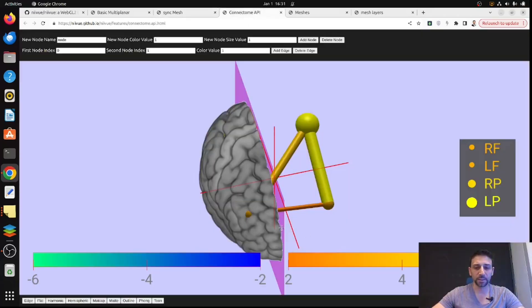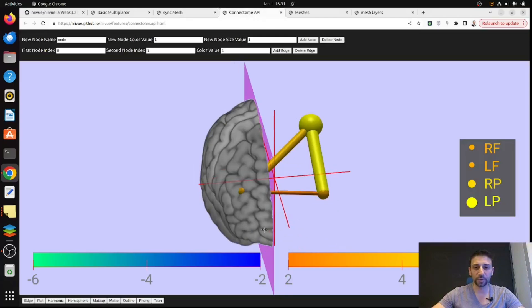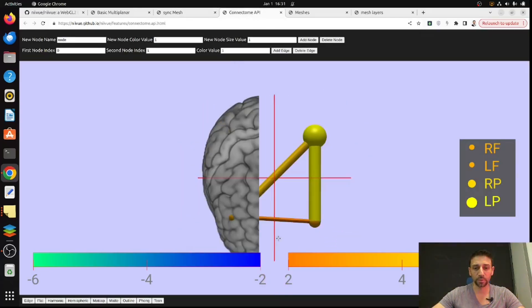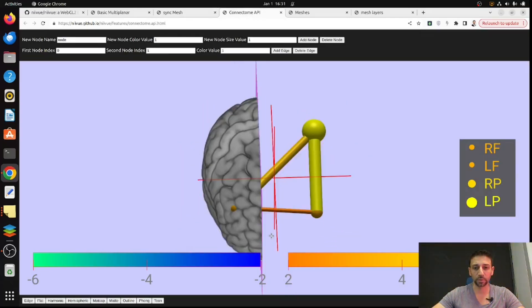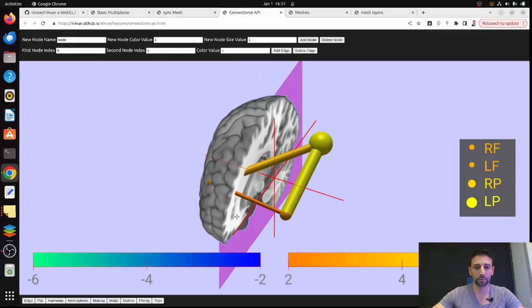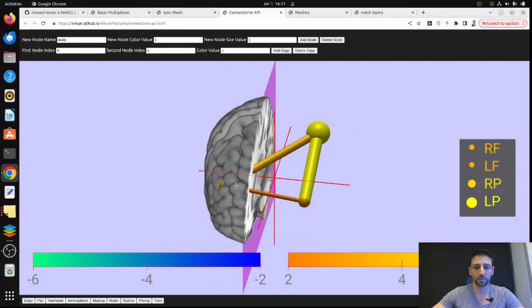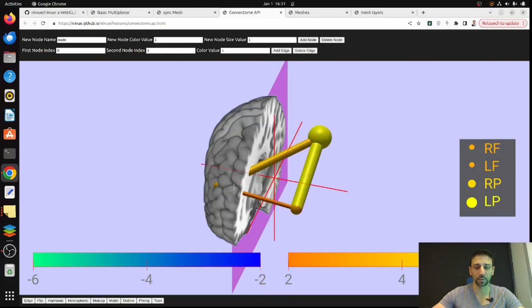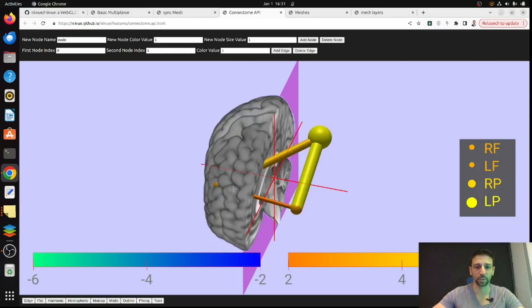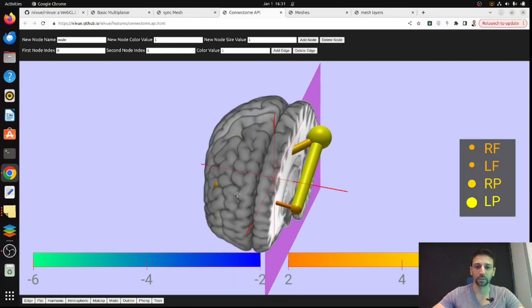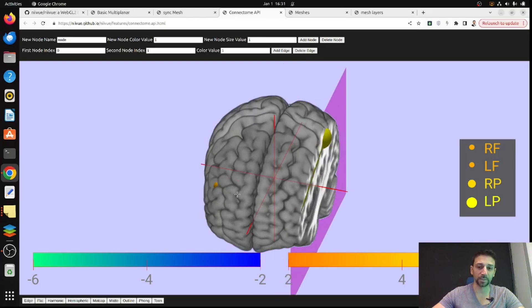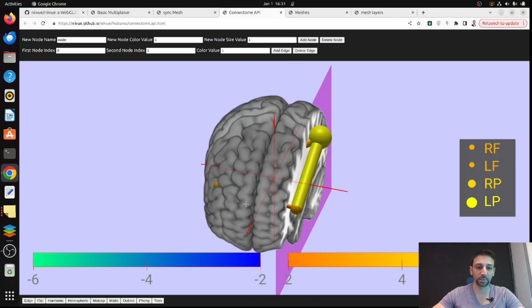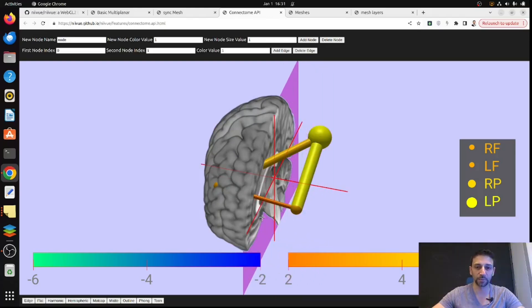Another nice thing I found is the visualization of a connectome, loading some kind of adjacency matrix or connectivity matrix and also overlaying an atlas. You can interactively play with it and see the nodes and edges of the connectome.